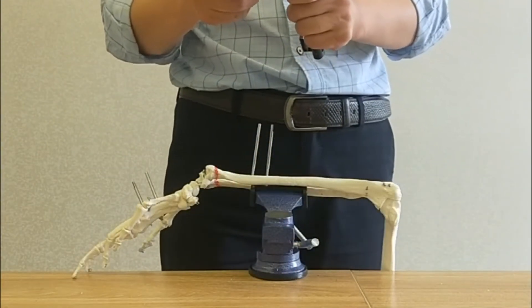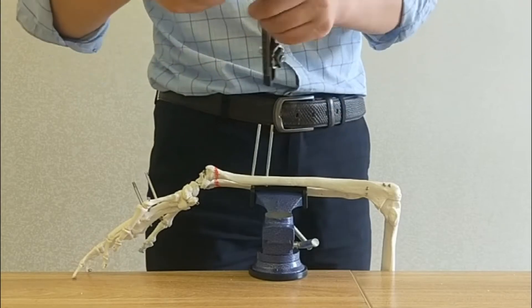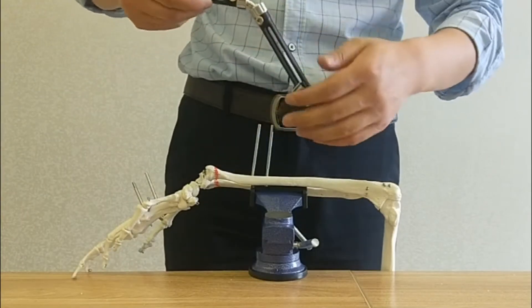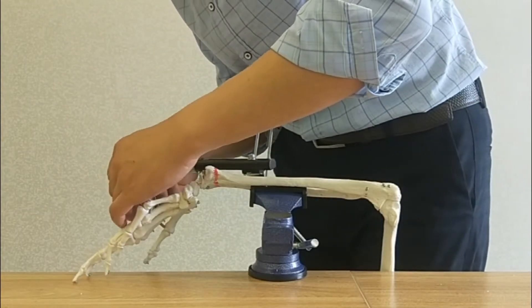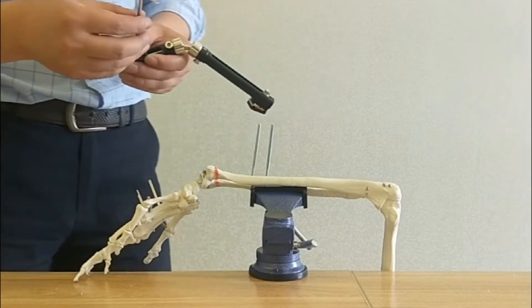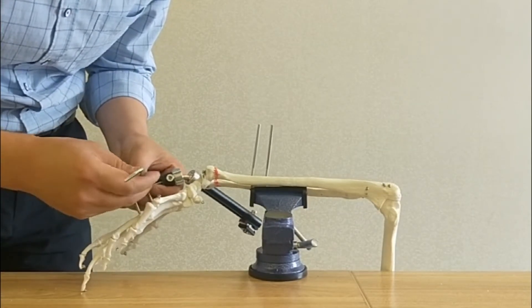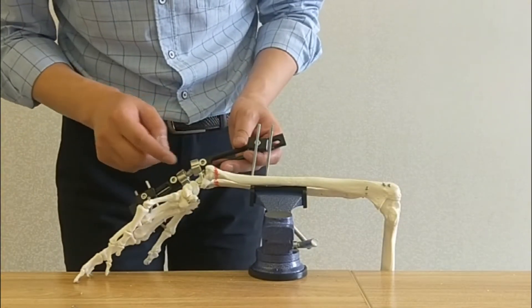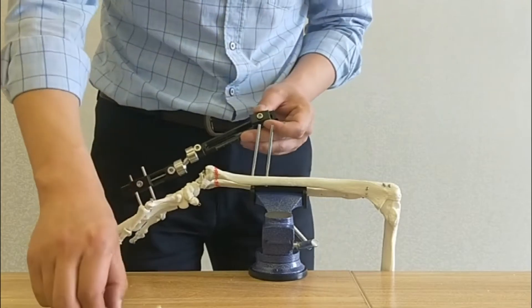Now let's loosen all the parts of the external fixation — loosen it, then assemble and pre-tighten. During assembling, the joint part is kept loose.